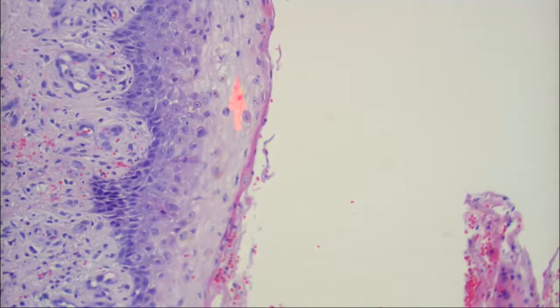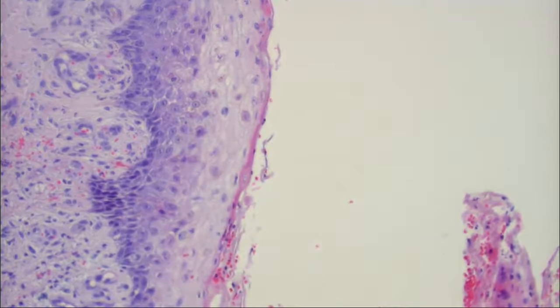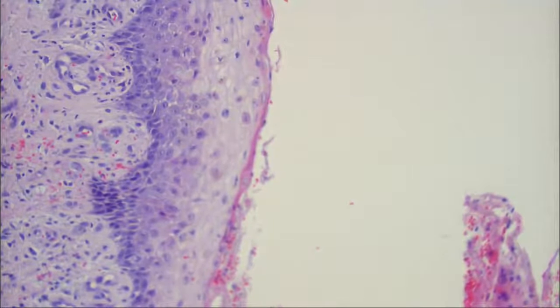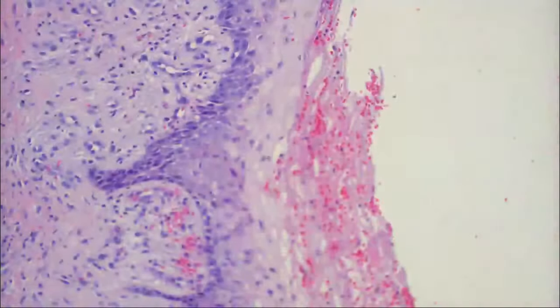What if she gave you one of the things you held in your hand that went up in the air? A little balloon. Ballooning, yes. These are like little balloons in the epidermis here. So it's ballooning, an intraepidermal alteration. So what diseases give you ballooning, pallor, slight psoriasiform hyperplasia of the epidermis?